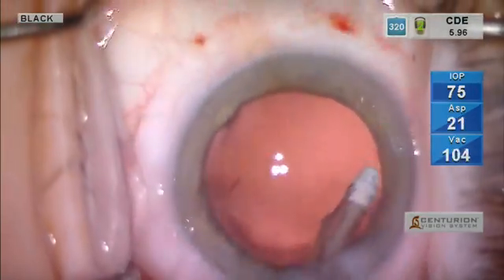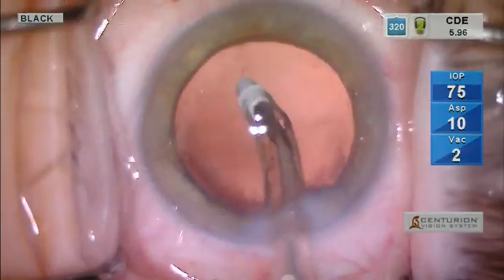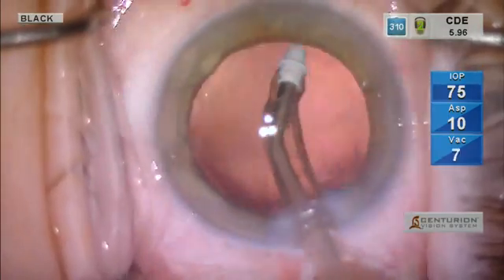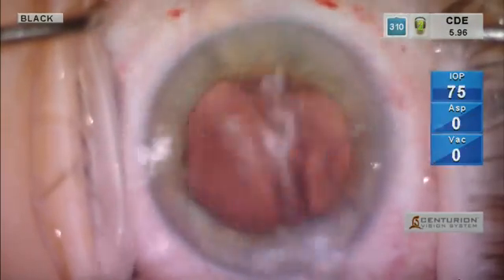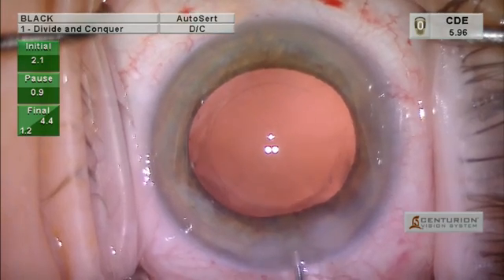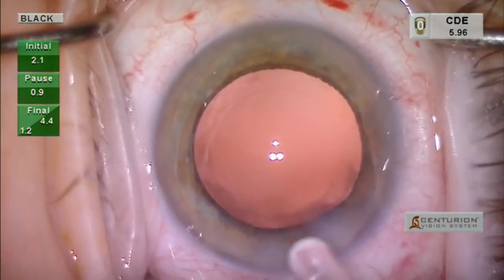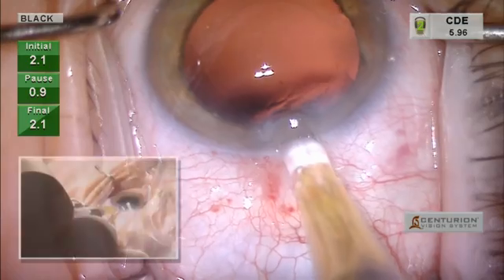We'll be removing that material. We are much more diligent as a result of this new microscope. Because of the visualization being so good, we can see to make sure that we have polished the posterior surface of the anterior capsule as well as the posterior capsule. Now, an argument is made that with a toric lens we might want to leave some of that cortical material for maybe better stability. We have not found that to be necessary with toric lenses. We like to remove as much of the cortical material as we can, even from the posterior surface of the anterior capsule, as we think it leads to less opacification, fibrosis, as well as inflammation.